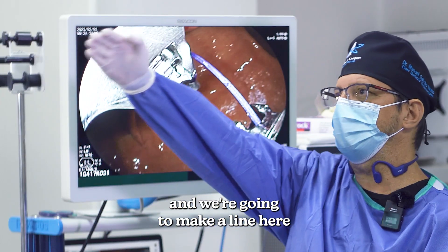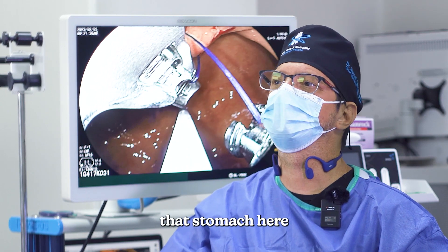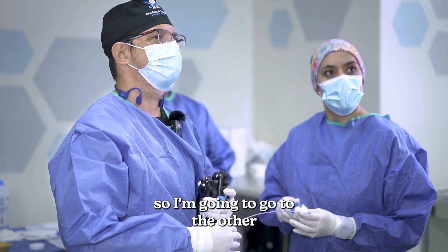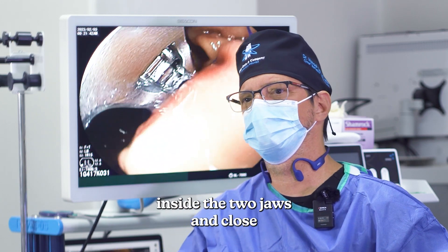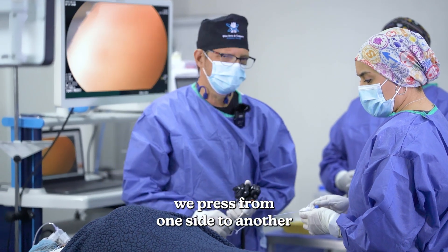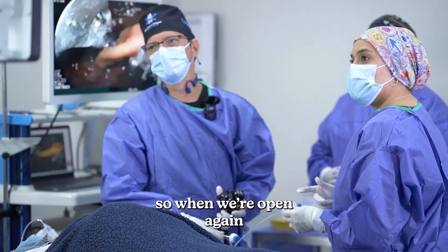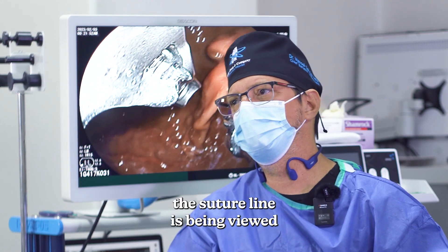And we're gonna make a line here, and we're gonna start crafting that stomach. I'm gonna go to the other — grab. Again, I'm gonna bring the tissue inside the two jaws. And we close, we press from one side to another. When we open again, we have it passed. So you can see here, the suture line is being built.